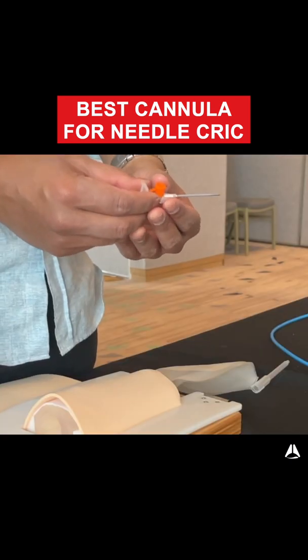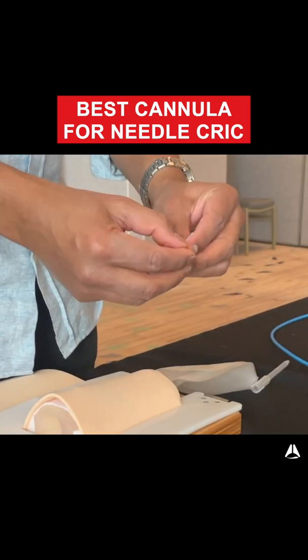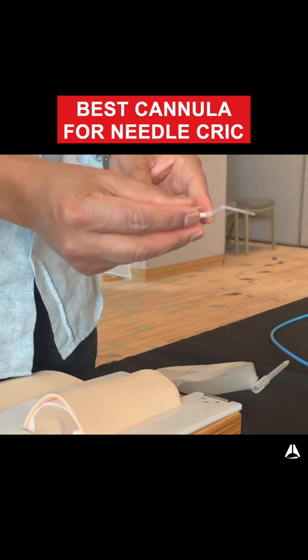This cannula here is a BD Venflon cannula. If I were to kink this cannula, it seems to still stay obstructed.